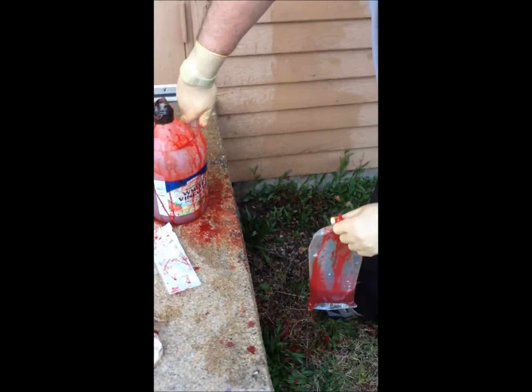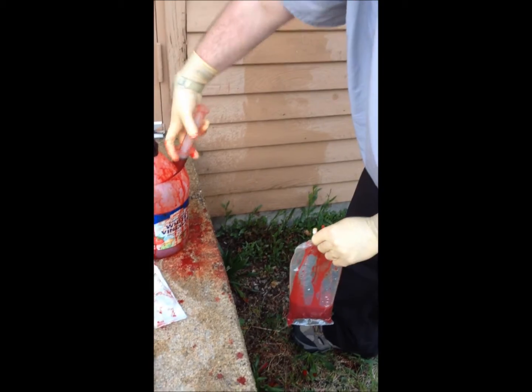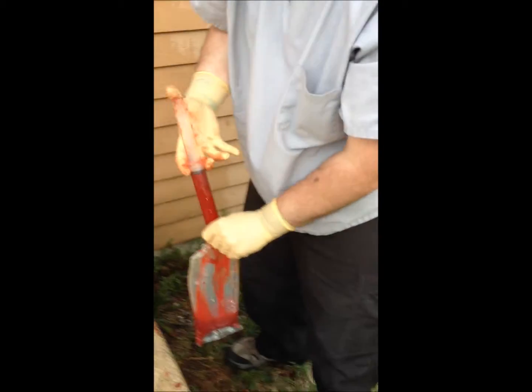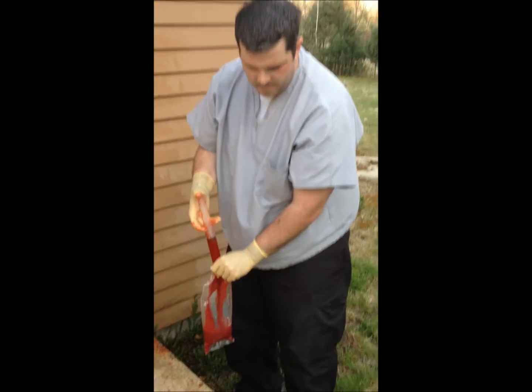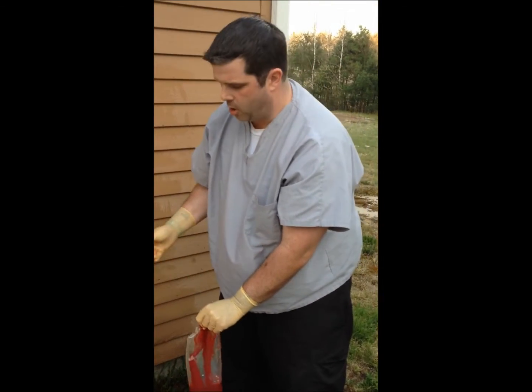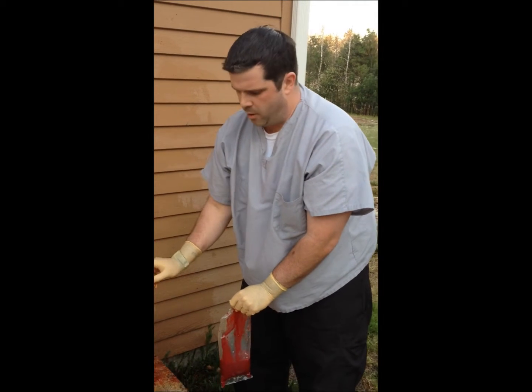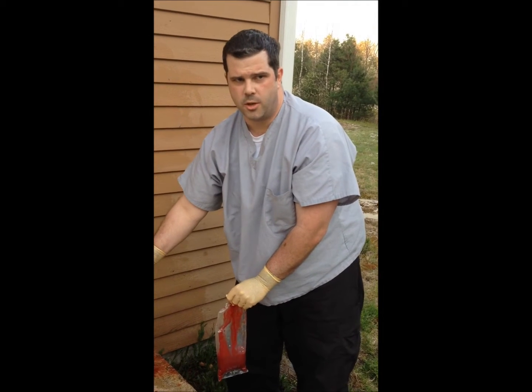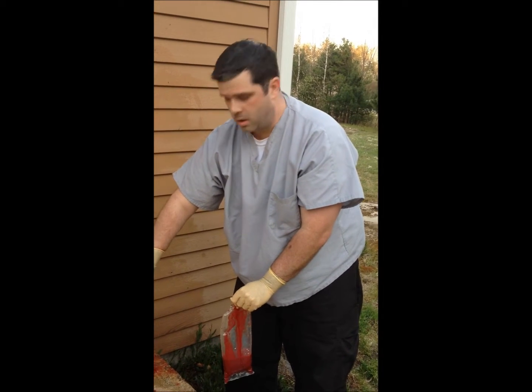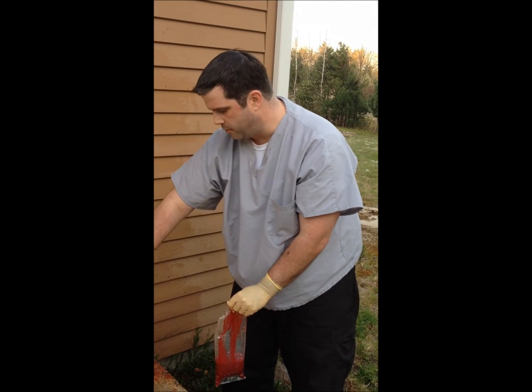We're just prepping for the arterial bleed demo. We're going to be using porcine tissue that's been penetrated by several different calibers of small arms: 9mm, .40 caliber, 7.62, .223, and, thanks to Matt DeVito, a .50 caliber Beowulf.